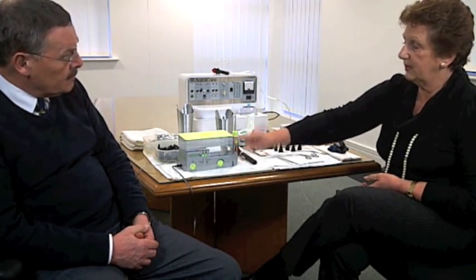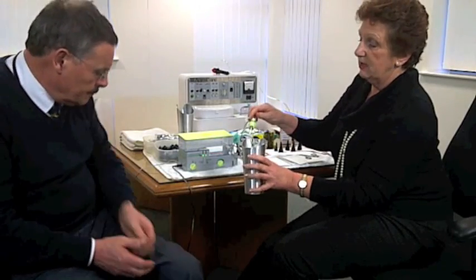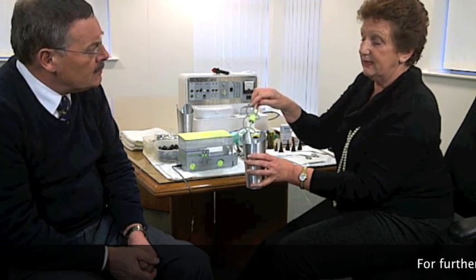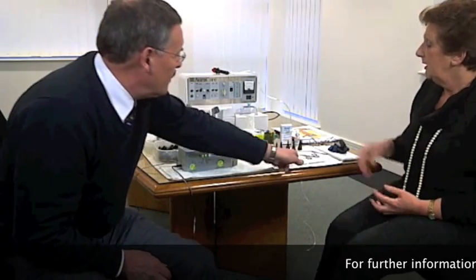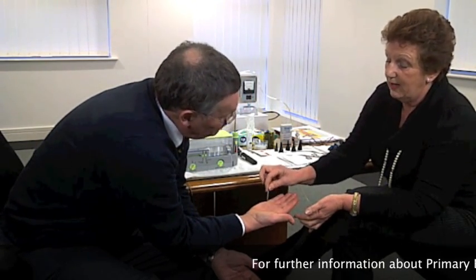So tell us a little bit about the equipment you use, Victoria, and what we're likely to see when we come and visit you in a clinic or one of the Ascent Hearing Care audiologists you've trained to do this job. The set up will be very similar to this. This is the irrigator — it has a reservoir of warm water, and this allows the clinician to use a small amount of water through the lance. That will be body temperature water with little pulses, very much more delicate than the traditional syringing process. We also have a Jobson horn probe, which has a small ring end, and that helps to loosen the wax from the ear canal.